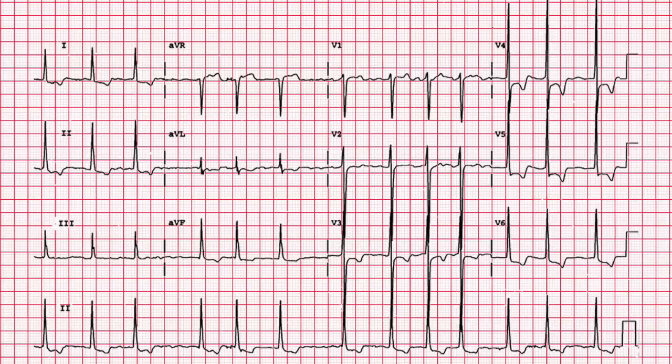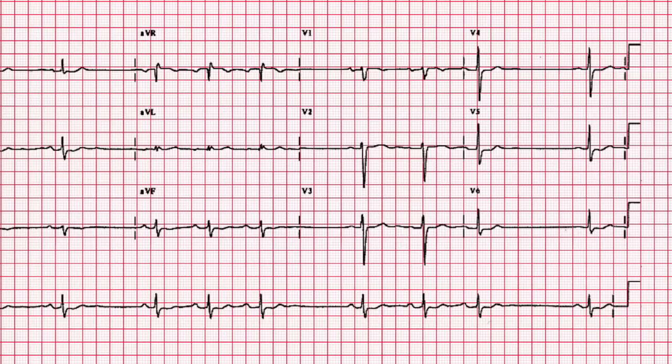The pattern seen here is atrial fibrillation — the rhythm is irregular and unpredictable. The rhythm seen here is a type of AV block. This is Mobitz Type 1, or Wenckebach. With this rhythm the QRS drops every fourth beat, causing an irregular rhythm that is nevertheless predictable.